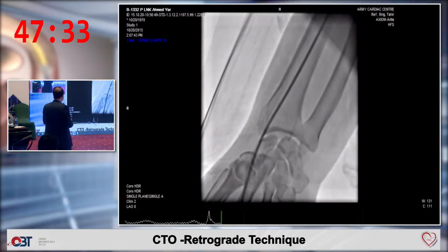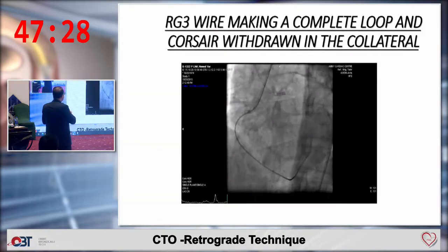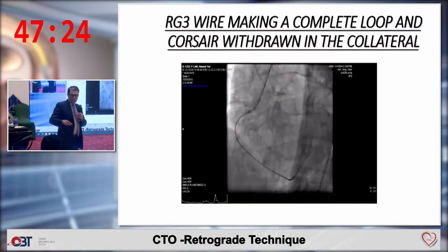This is where we are snaring. And I think the antegrade guide was in the radial, so that's why you saw the snare catching on the.